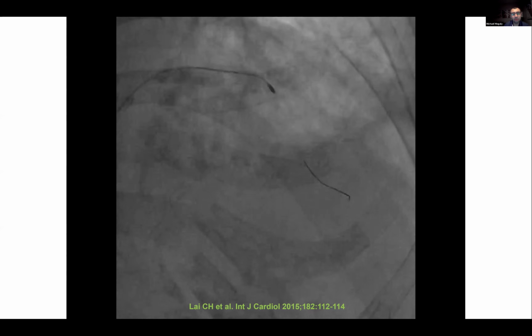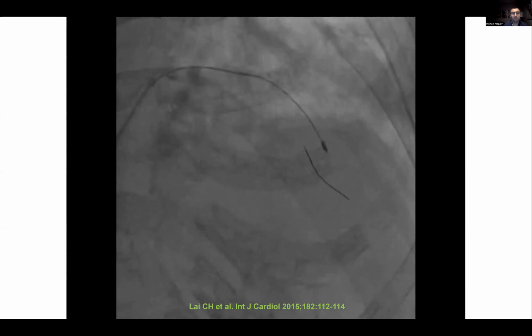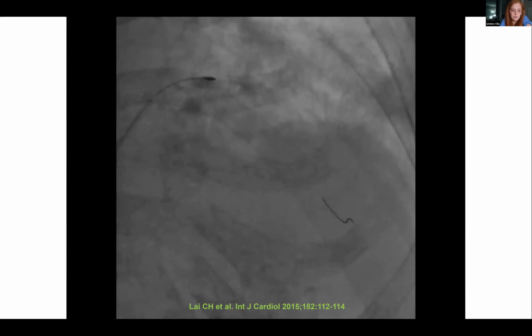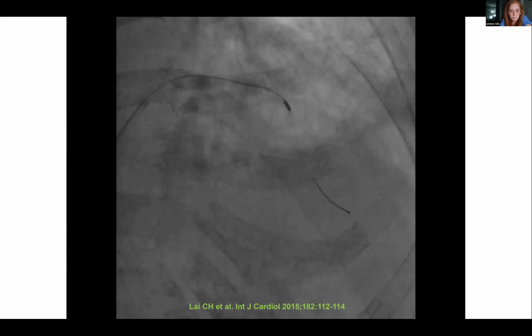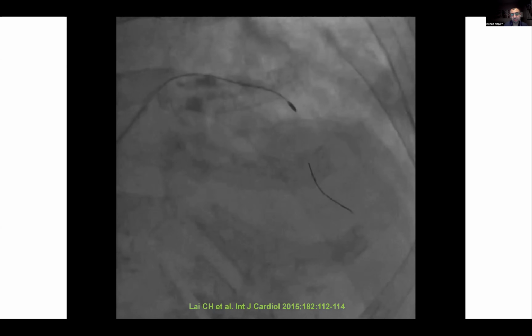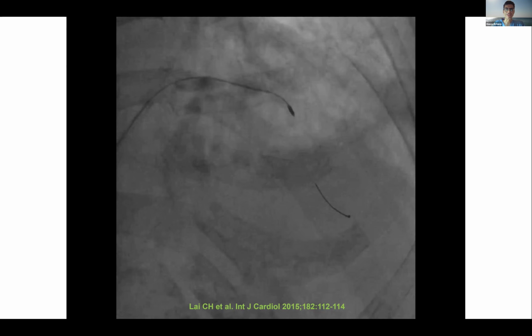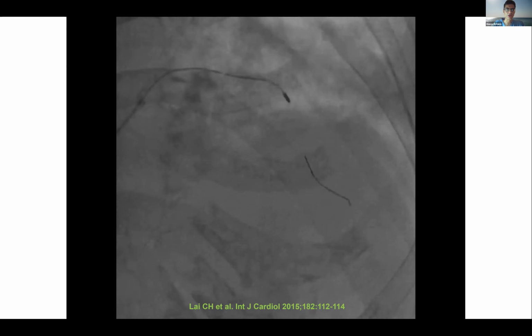Yeah. All right, so, Mike, what do you think? Yeah, the burr is following the wire. That makes me more comfortable. And now I see that it's next to the wire, so completely off the wire. So perf. This is something you don't want to see in your life, but if you see that, you know that this is not going to be pretty, obviously.